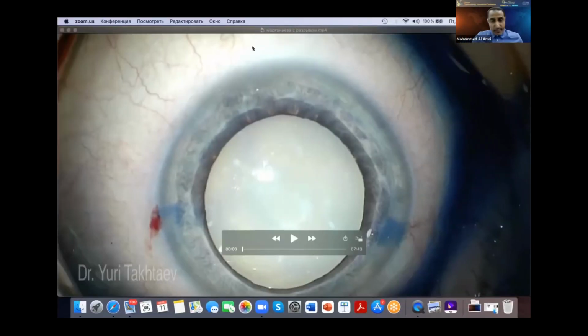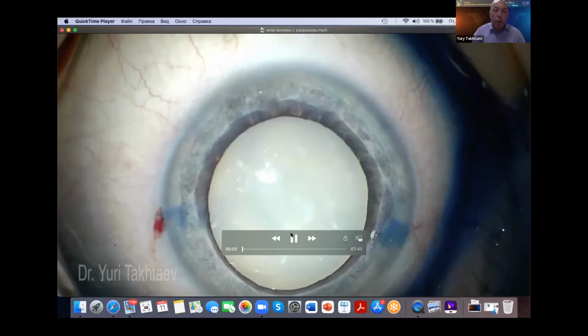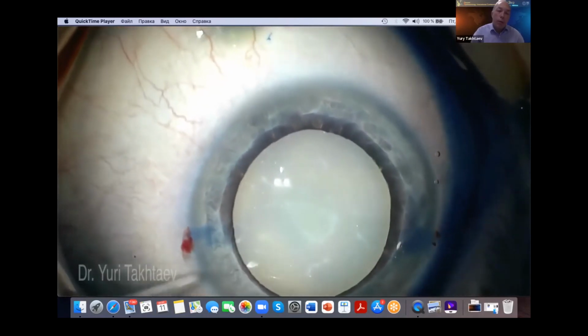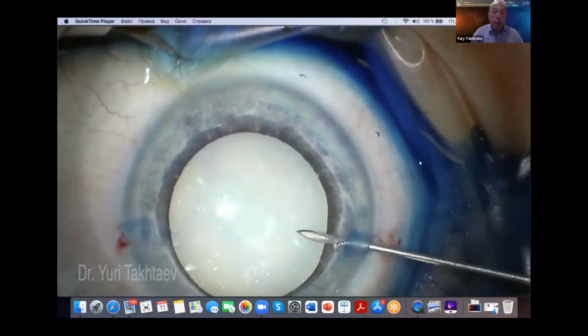Thank you very much. Thank you for the kind introduction and invitation, Dr. Mohammed. My topic is the Morgagnian cataract case. I have to say that the fellow eye was operated on 10 years ago, but the patient decided to postpone the second surgery, so we have all the calculations for this case. The first eye was done with a multifocal implant, and we are also looking to put a trifocal IOL in this Morgagnian cataract case.